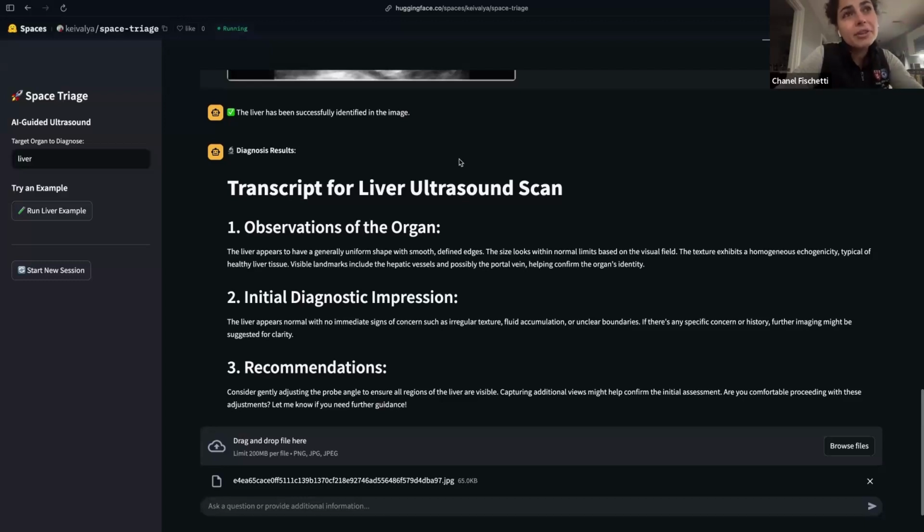The one thing that's very difficult, having worked in the AI space specifically within ultrasound, is that ultrasound, unlike MR, CT and X-ray imaging, has thousands, millions more frames per clip compared to CT and MRI images. What makes it really hard to create the AI models is that there are hundreds of frames even within a 6-second clip. That's why the annotation can be very difficult and why the models can take so long to train, because the nuances are so different.